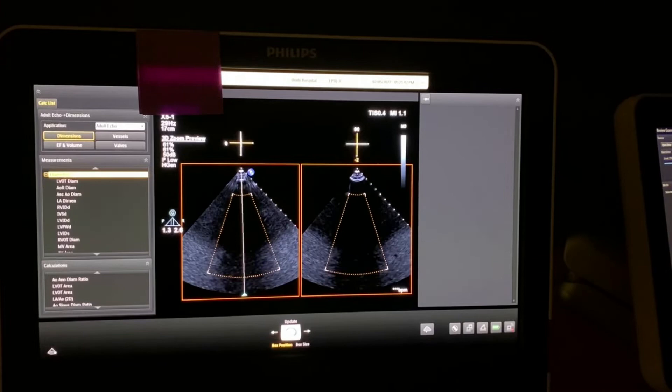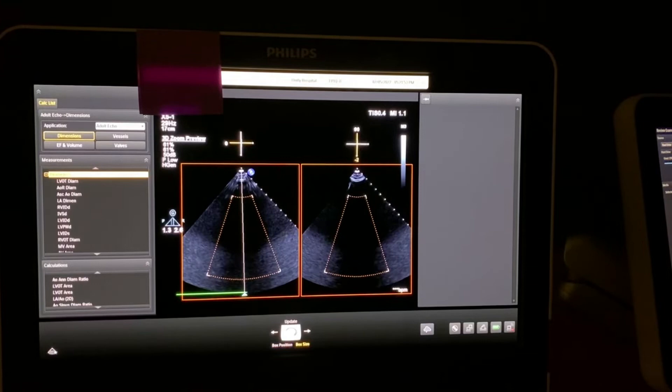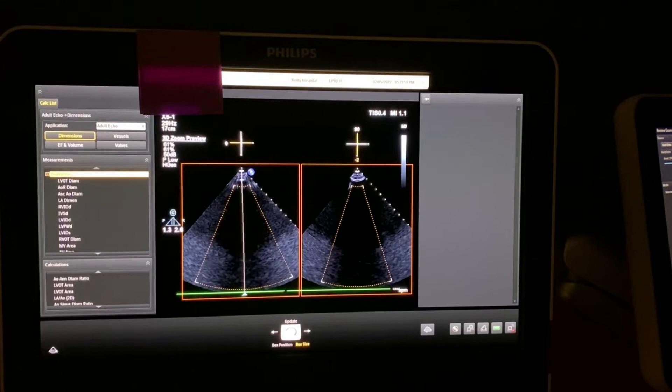I'm moving the trackball left and right. Now in order to get just the mitral valve annulus, you left click so that it goes from box position to box size.